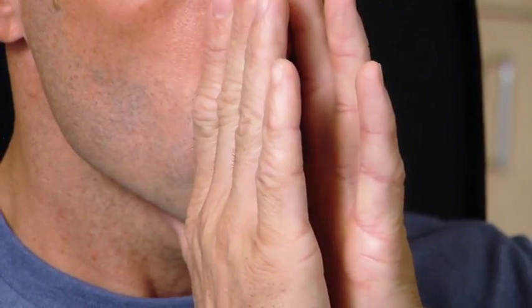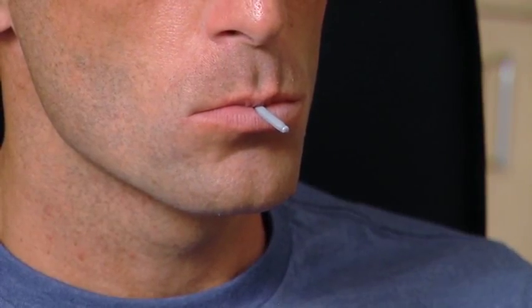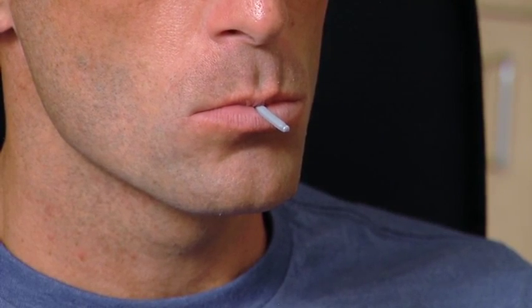Place the tray over your lower teeth. Be sure that the adjustment post is directly aligned under the nose, as this will center the tray. This can be accomplished by looking in a mirror. Bite down gently and close your lips around the tray for 1 minute.